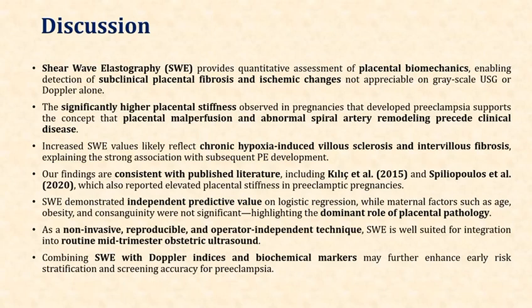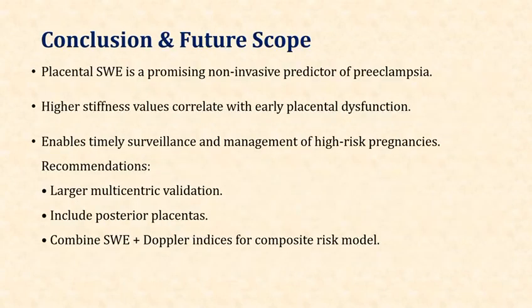As a non-invasive, reproducible, and operator-independent technique, shear wave elastography is well suited for integration into routine mid-trimester obstetric ultrasound. Combining shear wave elastography with Doppler indices and biochemical markers may further enhance early risk stratification and screening accuracy for preeclampsia. Coming on to conclusion, placental shear wave elastography is a promising non-invasive predictor of preeclampsia.